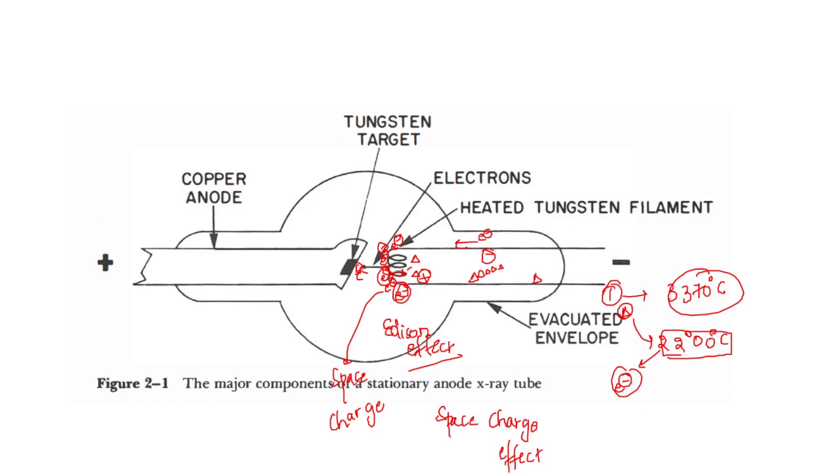This electric current will flow only from cathode to anode, that is, in one direction only. This emission of electrons will produce the X-ray tube current. Whenever the electrons flow from the cathode to the anode, this results in an X-ray tube current of around 100 milliamperes.